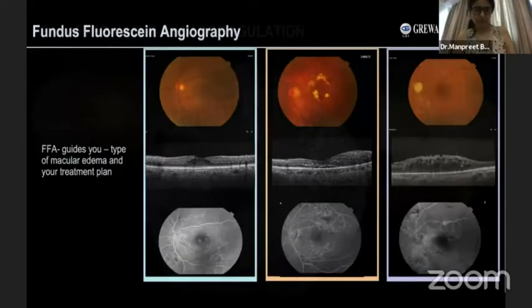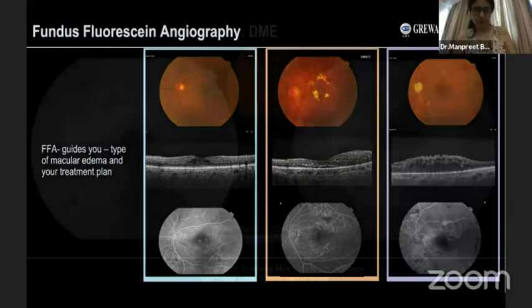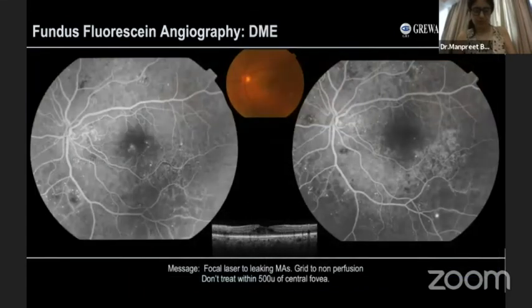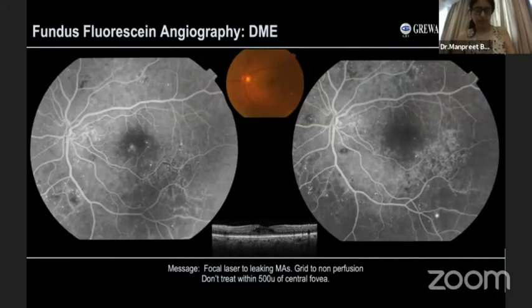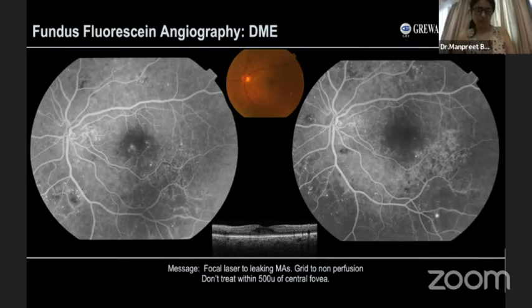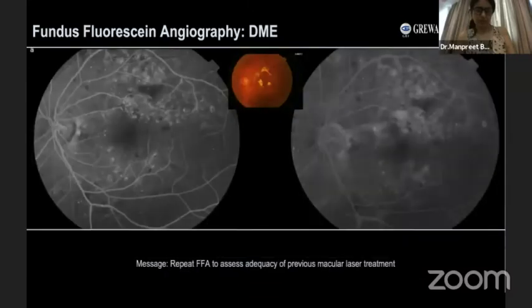Coming to the role of fluorescein angiography in diabetic maculopathy: in situation one, focal leaks from microaneurysms are identified inferotemporal to the fovea in a case of non-ischemic DME. All you need to do is apply focal laser to the microaneurysms, remembering not to treat within the foveal-central area.